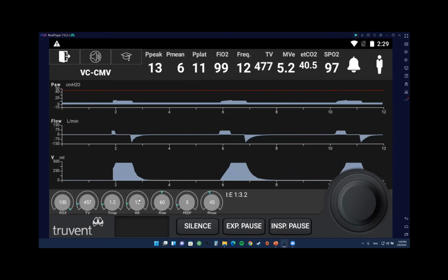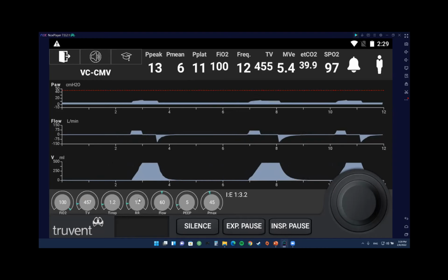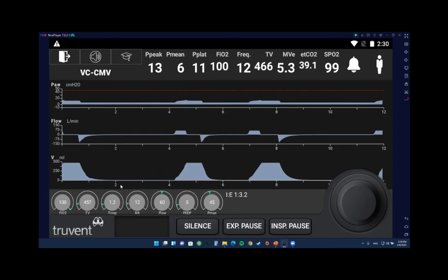And the moment to be aggressive is the moment the patient is sick. If you look at that gas, would you call that patient sick? Yes. So we have to be equally aggressive at trying to fix that gas. We cannot wait for the patient to get worse. We have to try to get that patient better. So you would ask me, how much rate would I give? And I'm going to give you a very empiric answer.